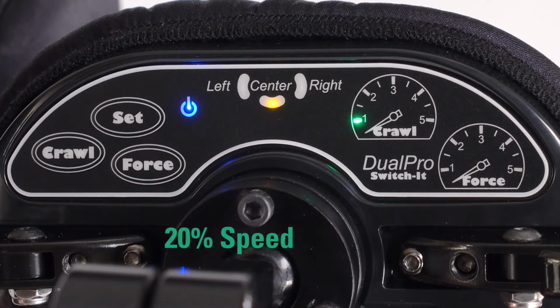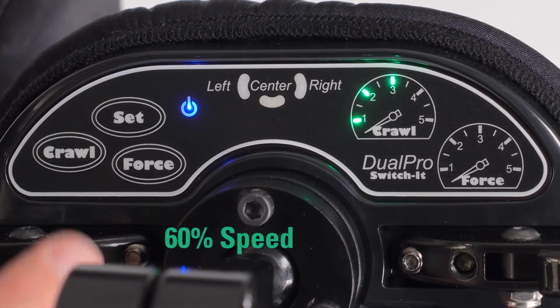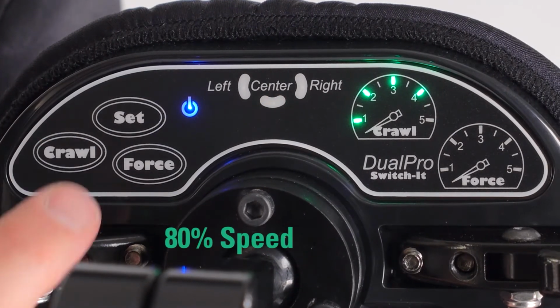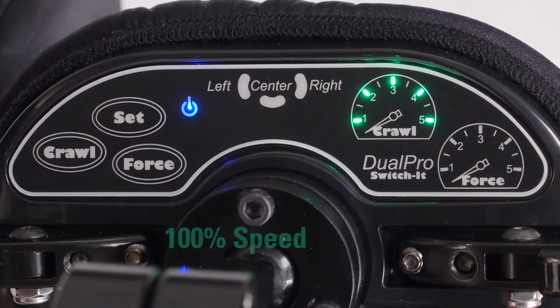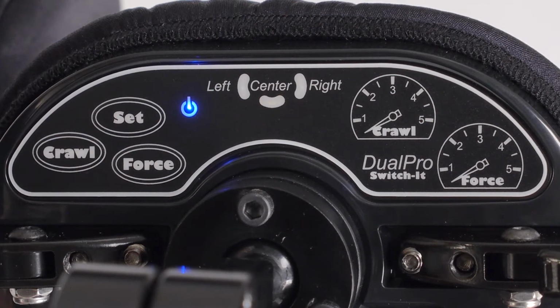If one light, the chair can reach 20% of its total speed using proximity. The second light 40%, the third light 60%, the fourth 80%, and the fifth 100%, assuming the chair is programmed to run at 100% speed. If the crawl button is pressed after all 5 lights are lit, the indicator cycles back to 0.